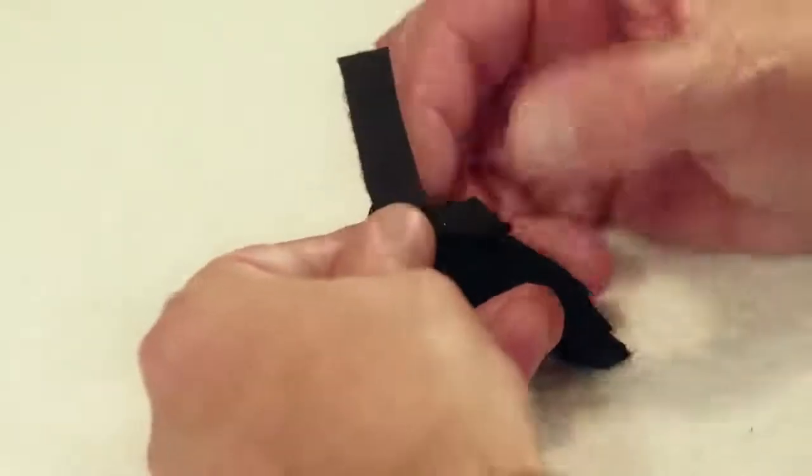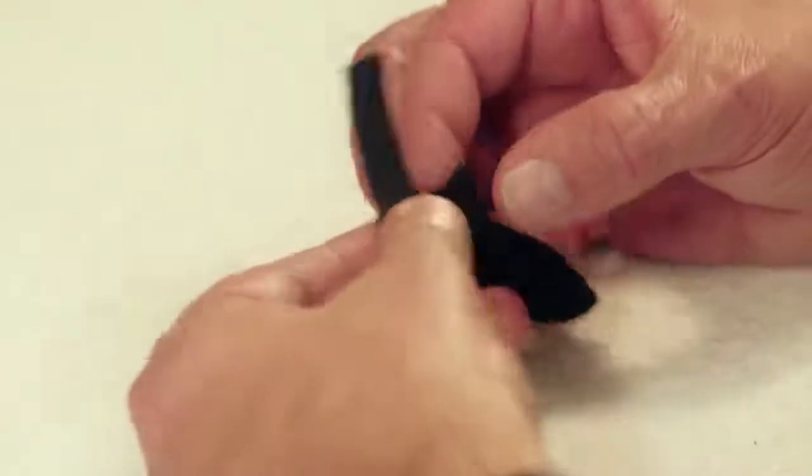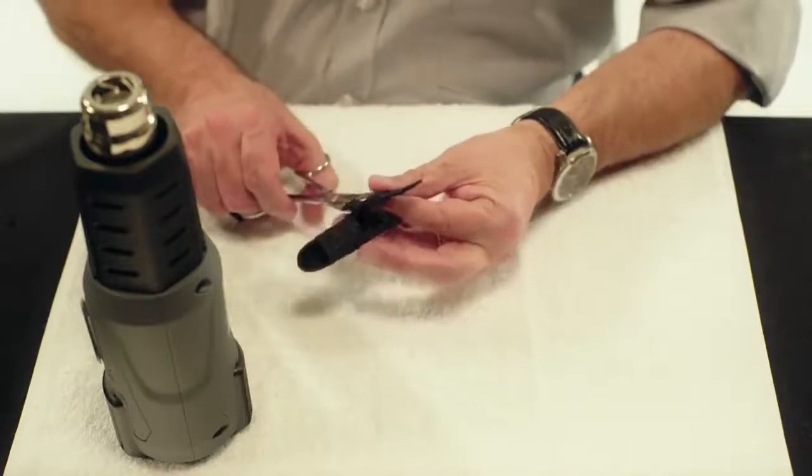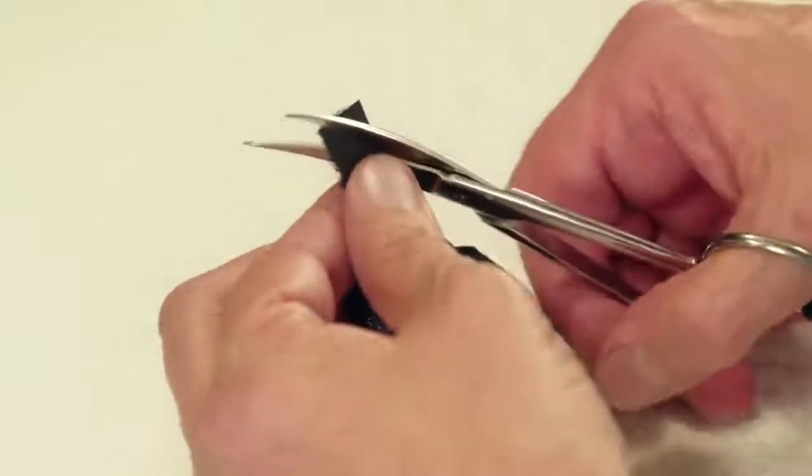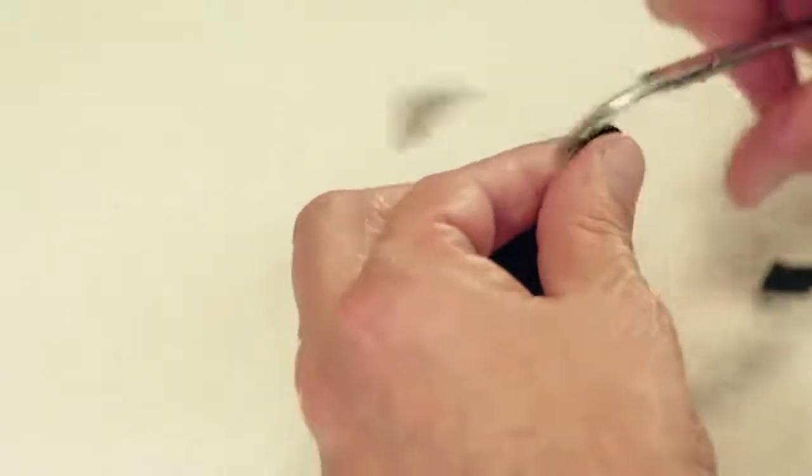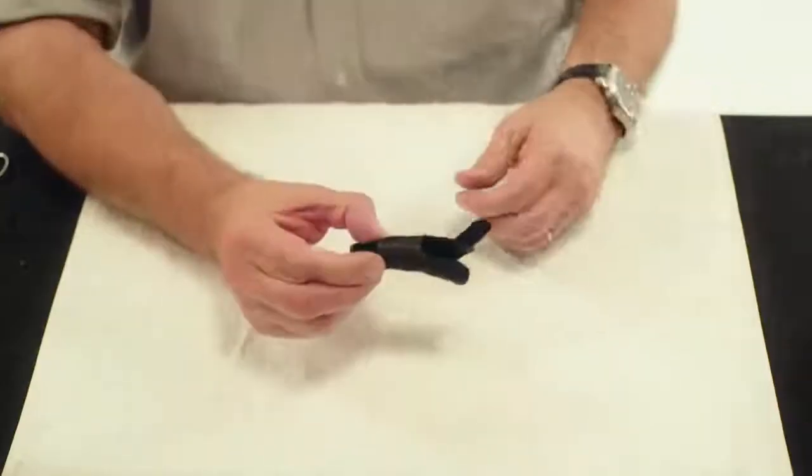Cut away any excess. The orthosis can now be secured to the patient's finger.